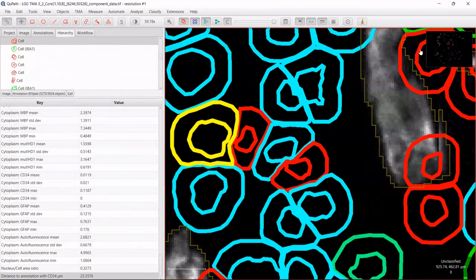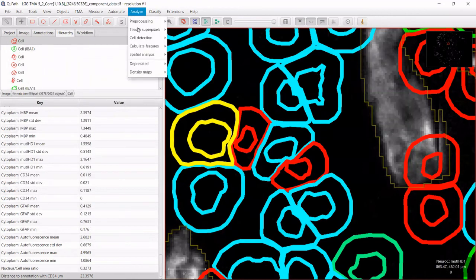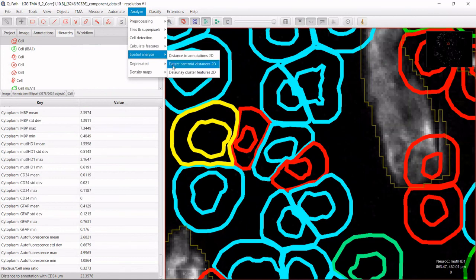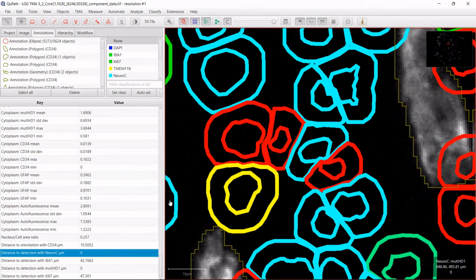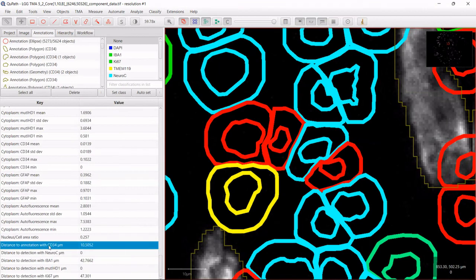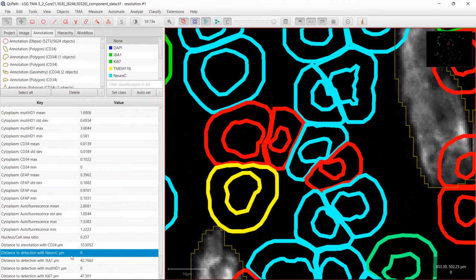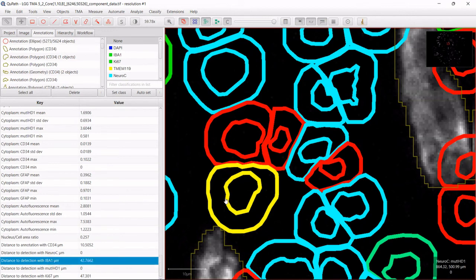Another spatial method I find very useful is, again under Analyze > Spatial Analysis, the Centroid Distances command. This adds new measurements for each cell: the distance to cells of other classes. For example, for the currently highlighted cell, we can see it is 42 microns away from the next IBA1 cell, and 47 microns away from a KI67 positive cell.